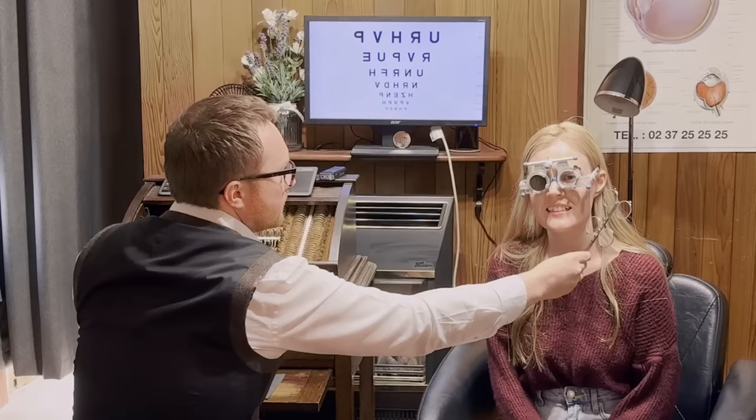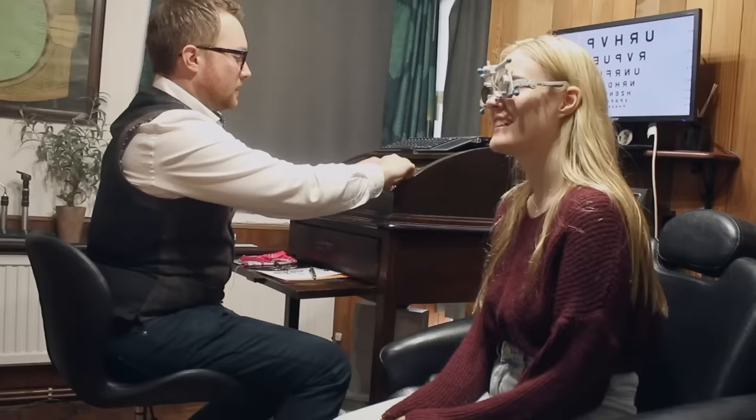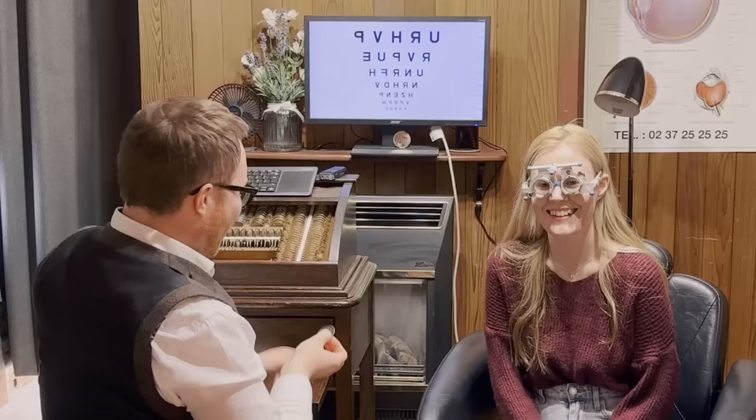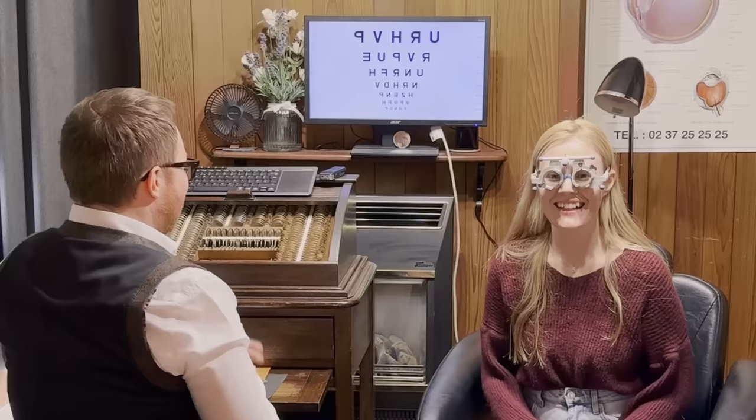Well, what I'm going to do now is make it go a little bit blurry, which will only be temporary. Has that sent them a little bit fuzzy there? Yeah. I'm going to uncover your right eye. Now, it's going to feel like you've had one too many because you're going to have one eye that's nice and clear, one eye that's quite blurry. Again, that's intentional. Have a few blinks just to let your brain sort of get used to that setup.